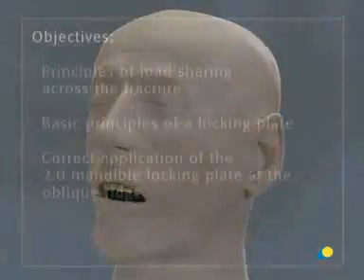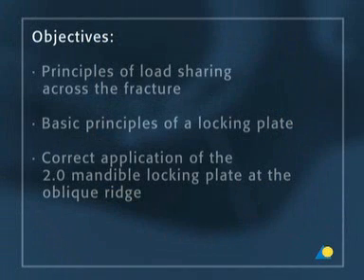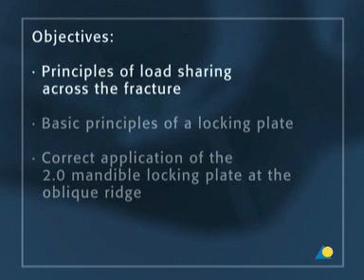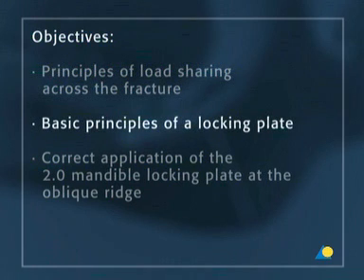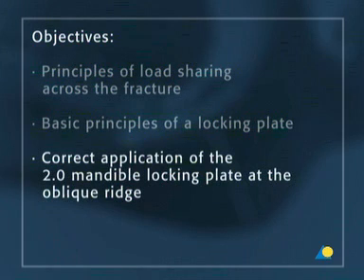A model with a simulated skin cover is used. The objectives of this exercise are to understand the principles of load sharing across the fracture, the basic principles of a locking plate, and the correct application of the 2.0 mandible locking plate at the oblique ridge.